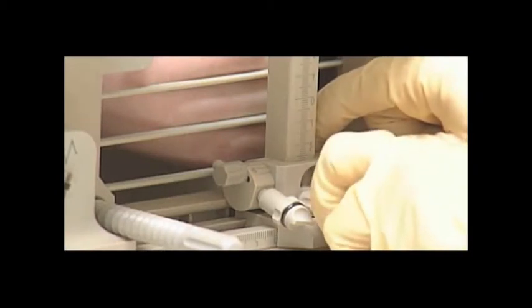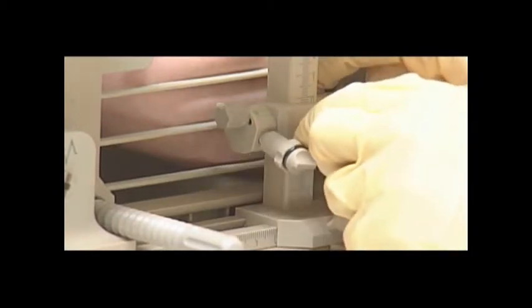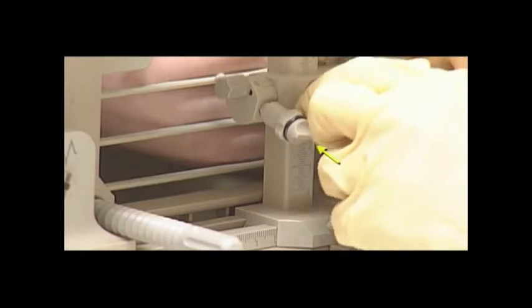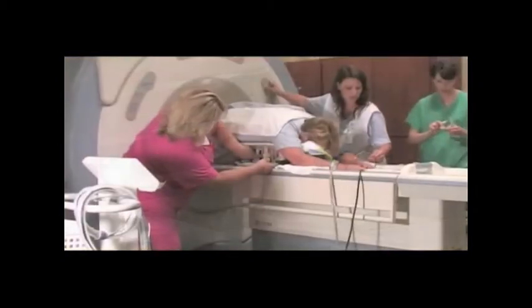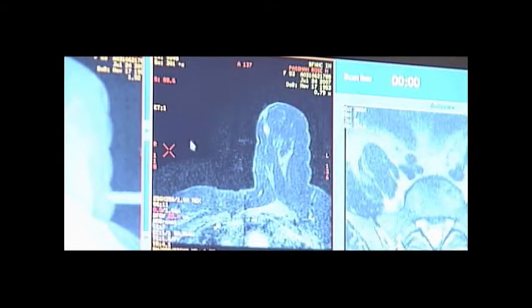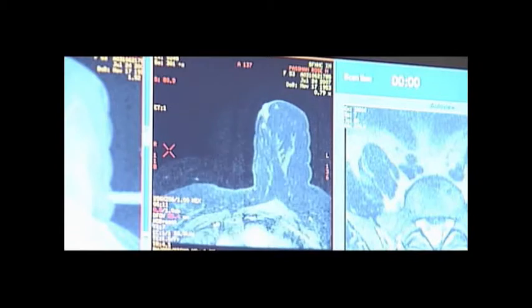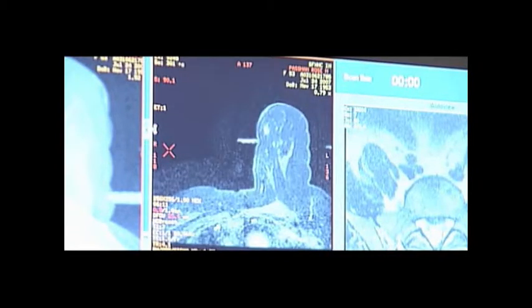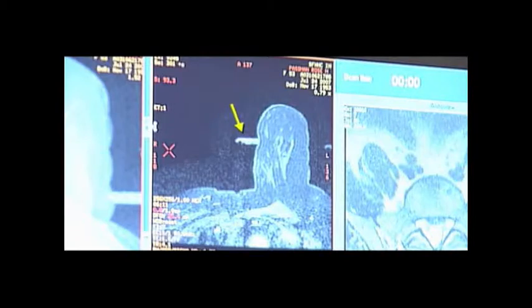Set the pillar column to zero in both the X and Y planes. Place the fiducial into the needle guide turret. Move the patient into the bore of the magnet for the first sequence of images. Perform a localizing scan to confirm that the area of interest is located within the compressed breast and the fiducial is clearly visible.